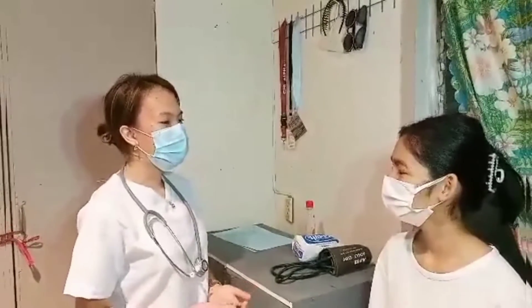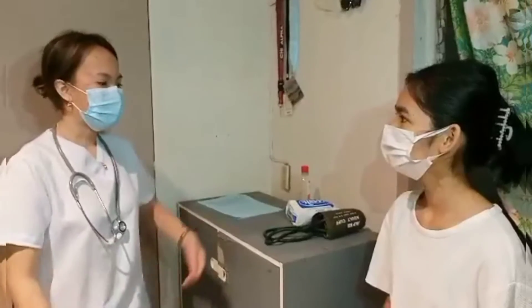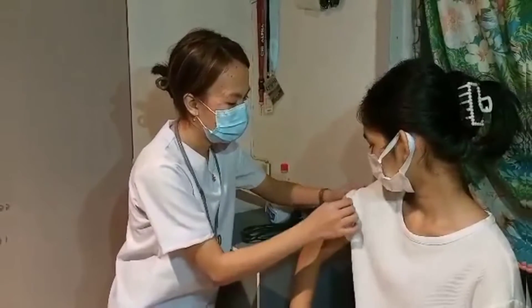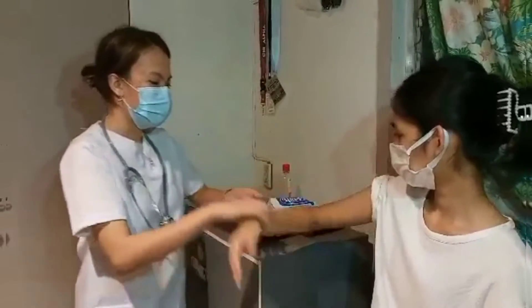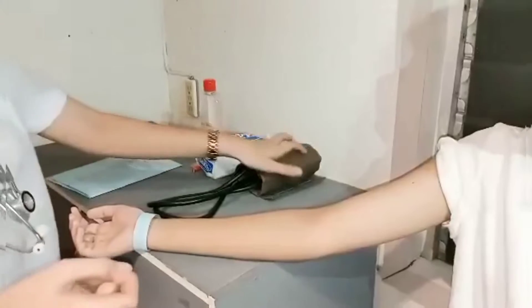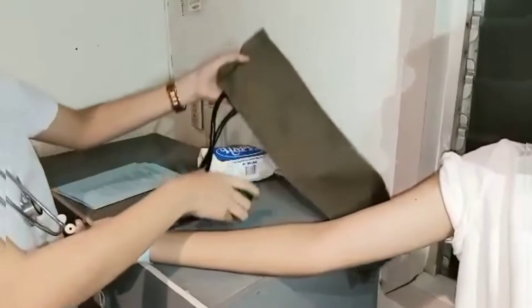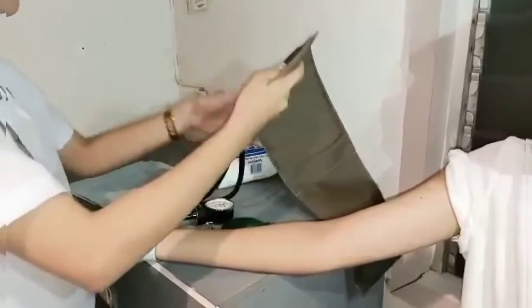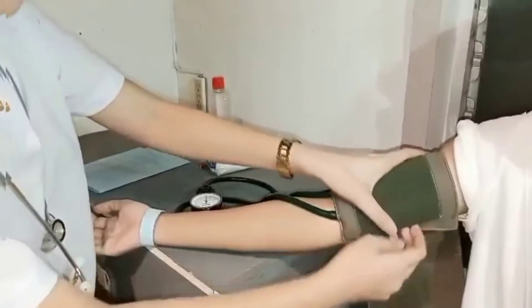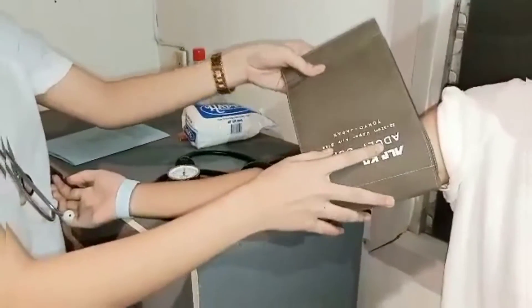The next thing we're going to do, ma'am, is I'm going to take your blood pressure. Will that be okay with you, ma'am? Yes. I'm going to roll up your sleeves, ma'am, for the cuff. Extend your arm with your palm facing upward and just relax. I'm going to place the cuff one to two inches above the inner aspect of the elbow with the bladder over the brachial artery.